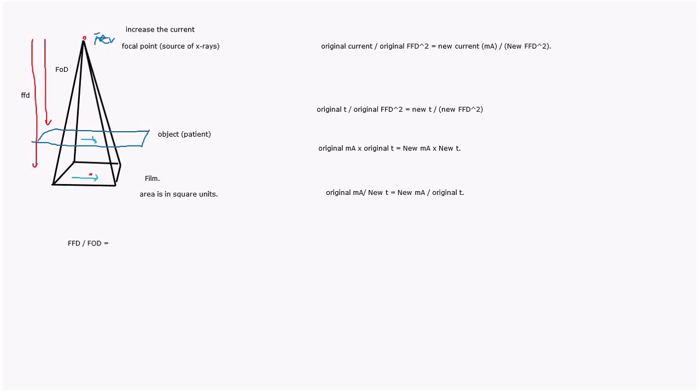Should be equal to the ratio of the two blue lines. Focus to film. Image on the film is proportional to object length.